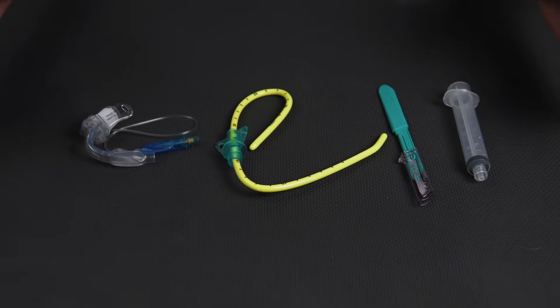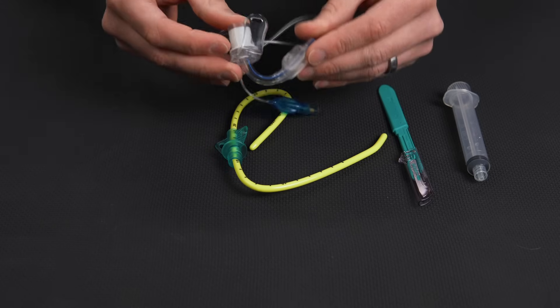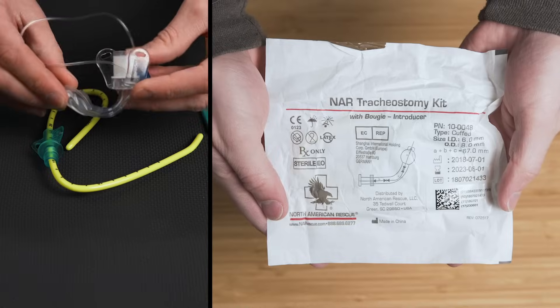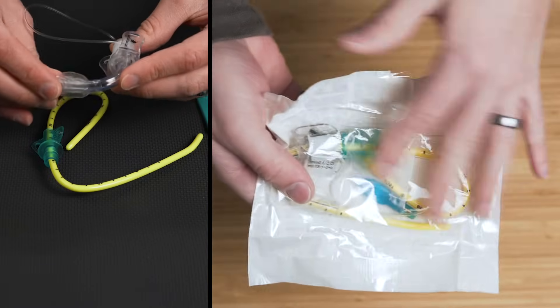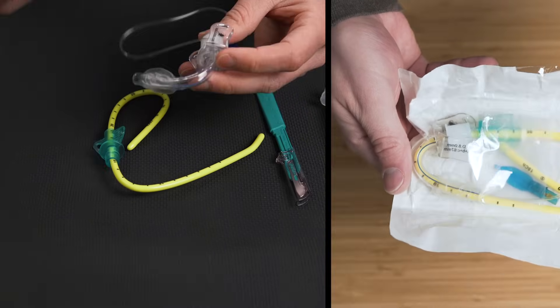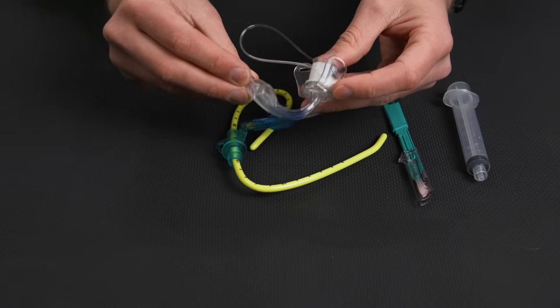So to perform this procedure, we need four main things. The first thing we need is the tube. Now this guy here is a specialized cric tube made by North American Rescue. I like using things that are actually made for this procedure because this prevents putting it in too deep, prevents cutting the tube down and causing any issues. It's just a lot simpler.